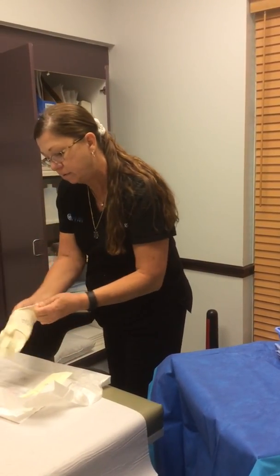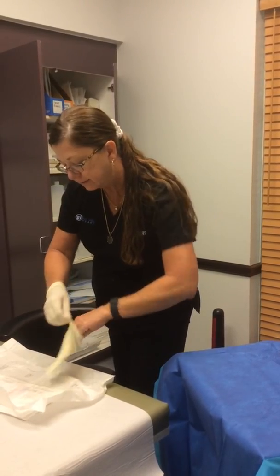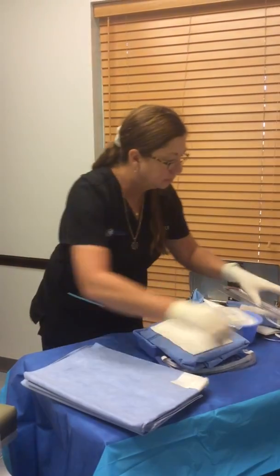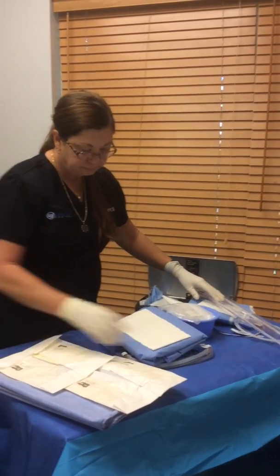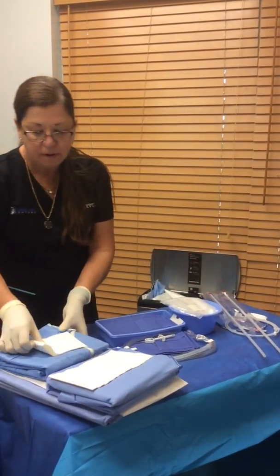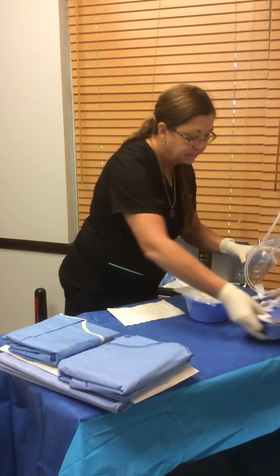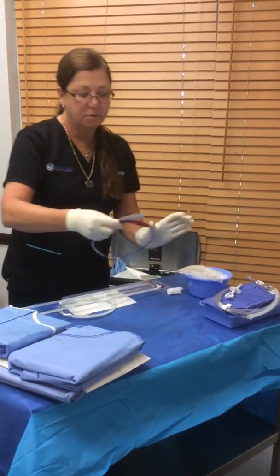This is the little table, so it's a little different for you, but it's the same idea. First thing is the sheet, the gloves, the gown, the other gown. Put the extra towel under there — this towel goes here — and I just set everything out of the way.